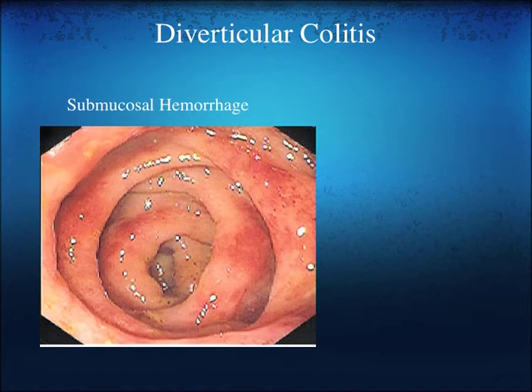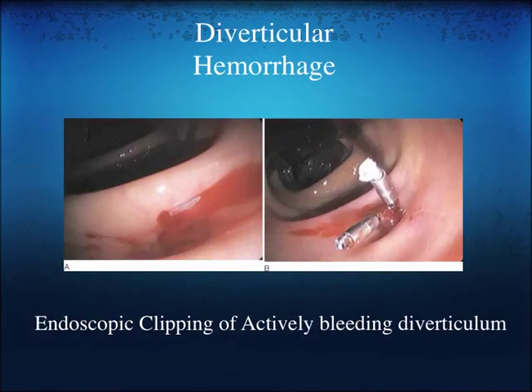Again, here's the endoscopic finding. You can see these almost look like bruised folds, and again, most of the time no symptoms are rendered, but sometimes this can result in a diarrheal syndrome.